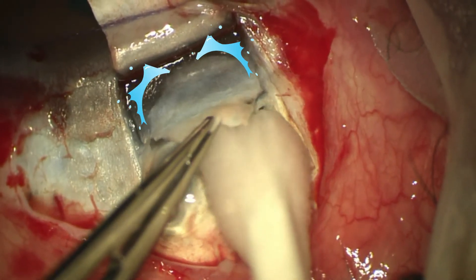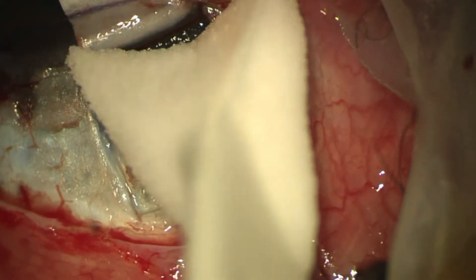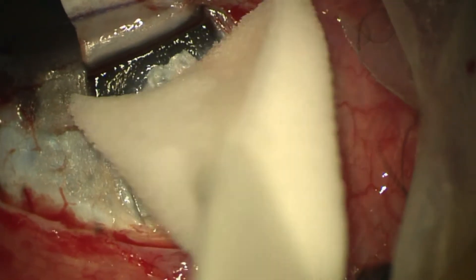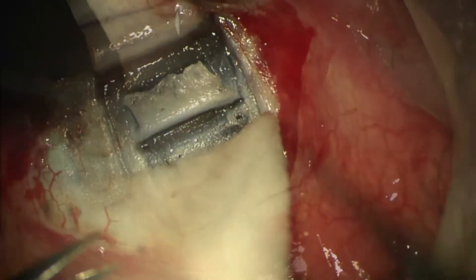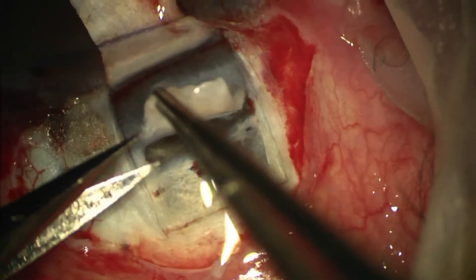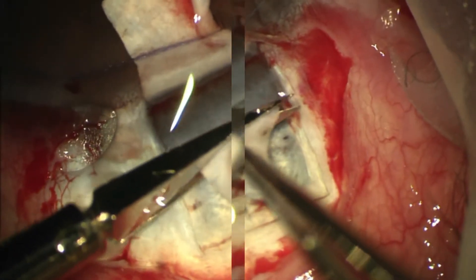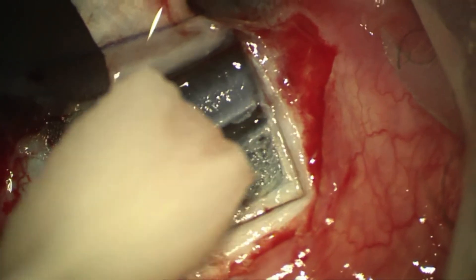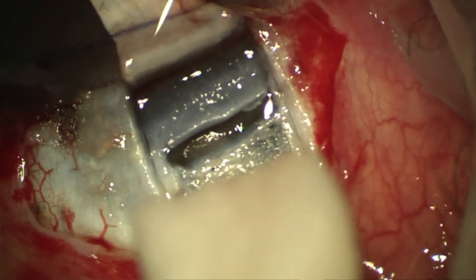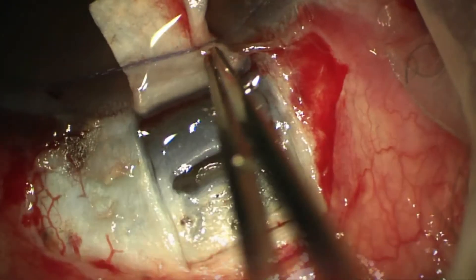As you may notice, we have very good filtration — the patient had high IOP before surgery. Once we are satisfied with the filtration, we cut the deep flap with scissors from its base. It is very important not to leave any stump, as this can limit filtration or block the trabecular-Descemet's membrane window.